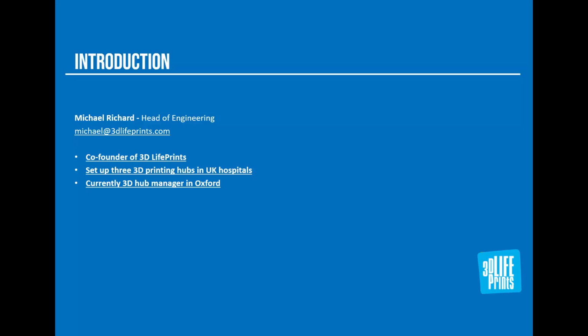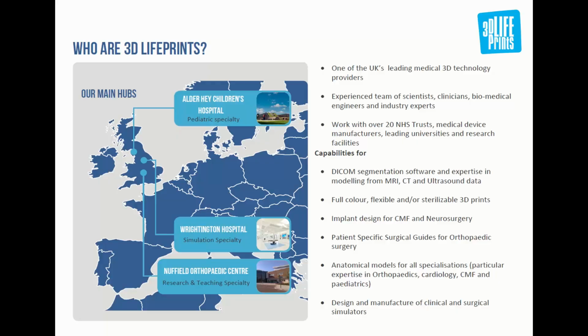I'm currently based in Oxford, where I am heading up our 3D printing hub here in the Nuffield Orthopedic Centre. And I've been working together with David and his team for some time now on many, many cases, probably done a couple hundred so far within Simpleware across our various sites.